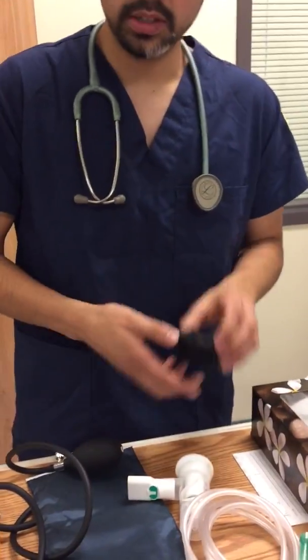I also want to make note that another indication for small volume nebulizers is for patients that just came into the emergency room and they need a breathing treatment, because like I said earlier, they can't take an inhaler. They have to be on a small volume nebulizer. Okay, so before I go in, I want to check to make sure I have all my equipment. I've got my stethoscope, a blood pressure cuff, the small volume nebulizer, which is important, a pulse ox, and my gloves and hand sanitizer, if there's any sanitizer inside the room.